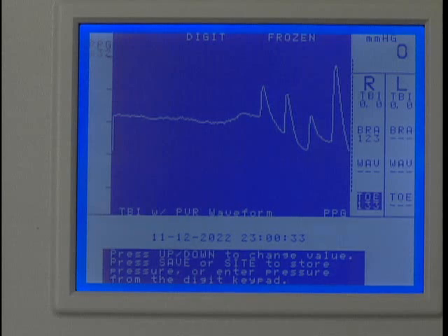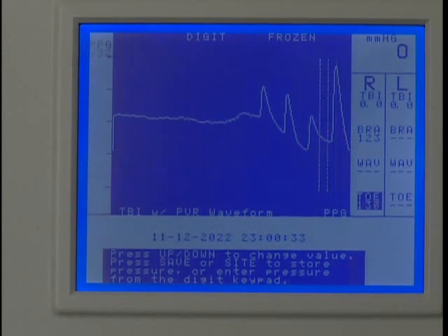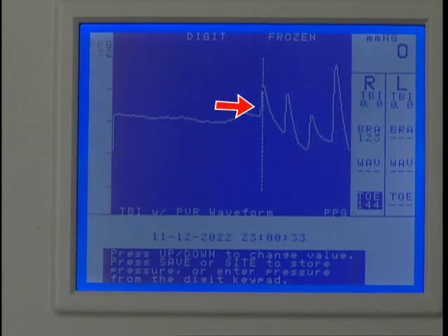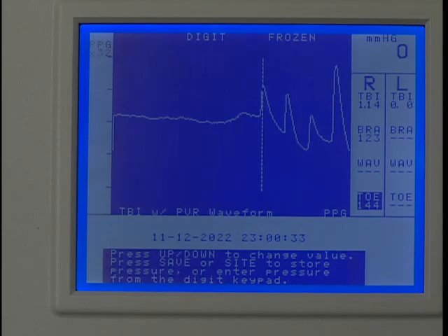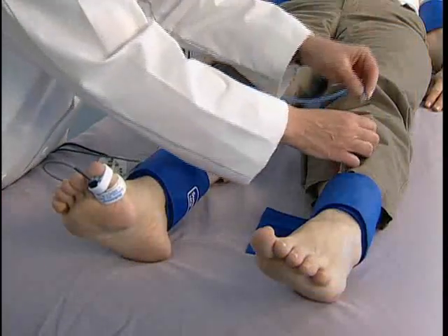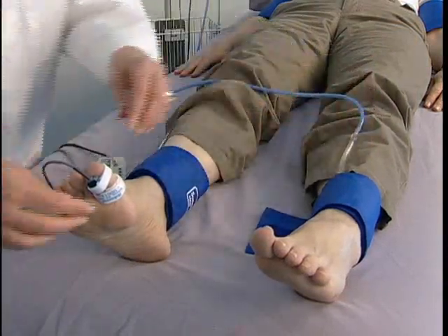Press the up or down key to move the caliper tool to the beginning of the first upward slope at the start of the pulsation, as shown. This is the systolic pressure. Press Save to record it, and the marker will move to the next protocol location. Continue these steps for the remaining sites to complete the exam.